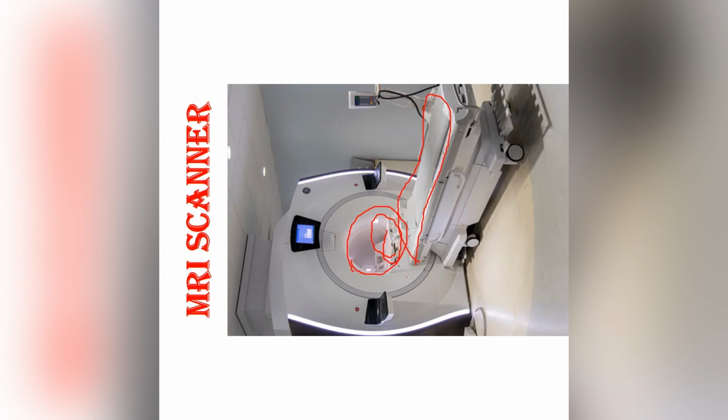This big MRI scanner is like a big magnet. It has a magnetic power more than 20,000 times that of Earth's magnetic field. So it's a super strong magnet. That is why people are advised not to carry any magnetic or metallic equipment into MRI setups.